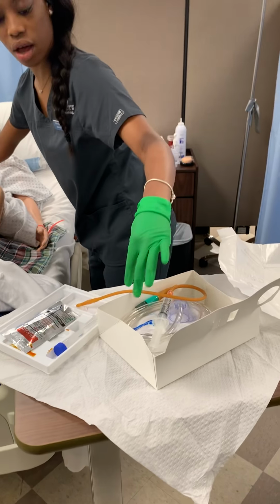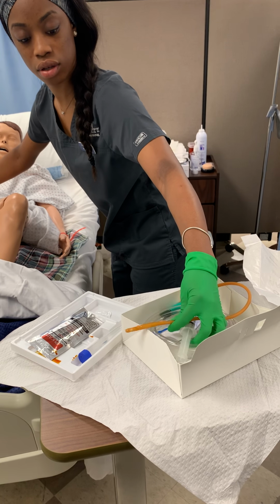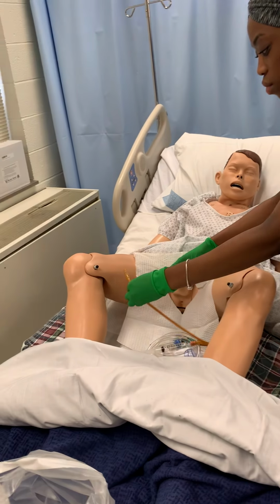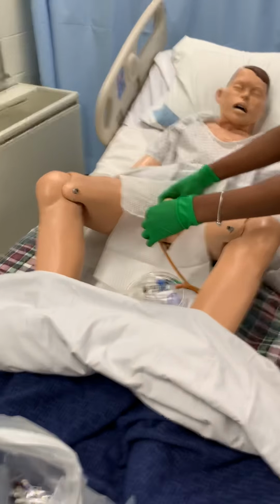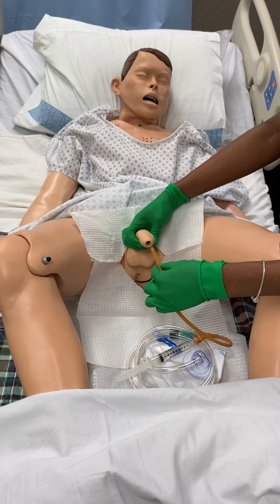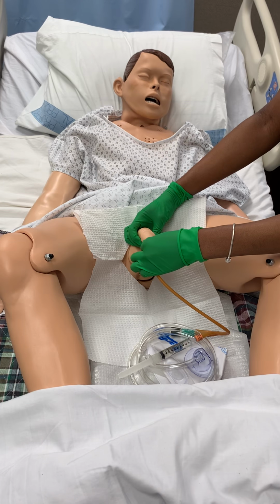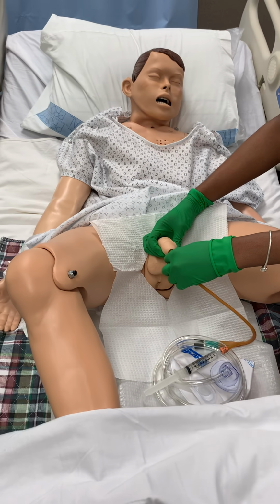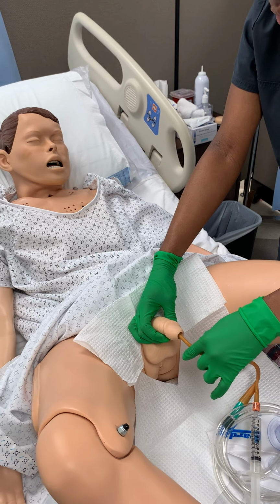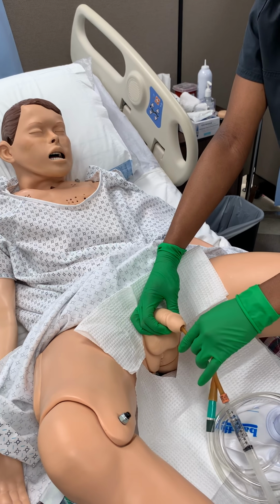Now that we did all that, it is time to insert the catheter. I will ask my patient to take a deep breath, and I'm going to insert once he exhales. Please take a deep breath, Mr. Livingston, and then exhale. Then you slowly insert the catheter, about 6 inches deep.